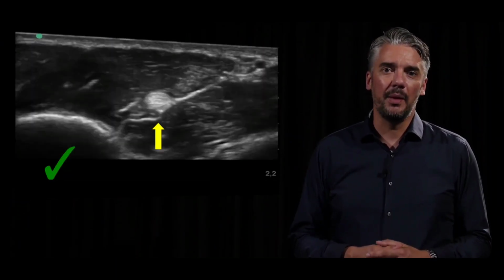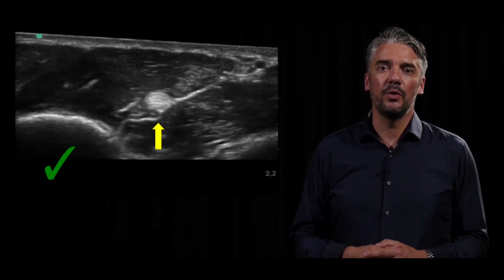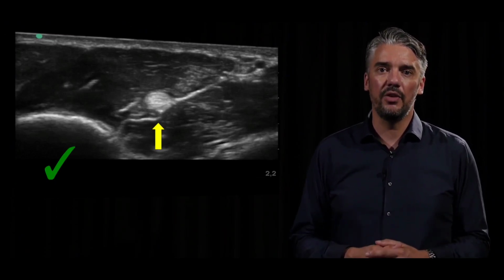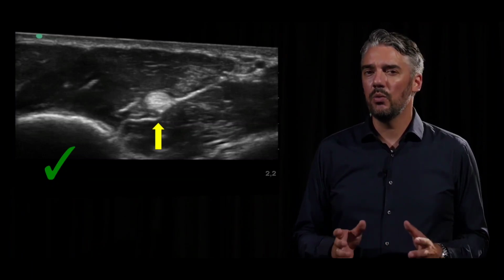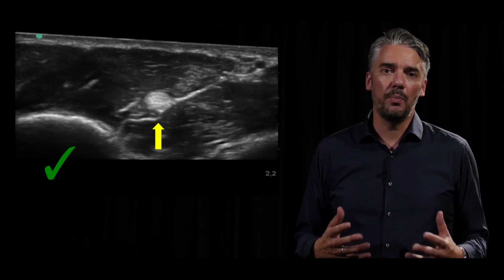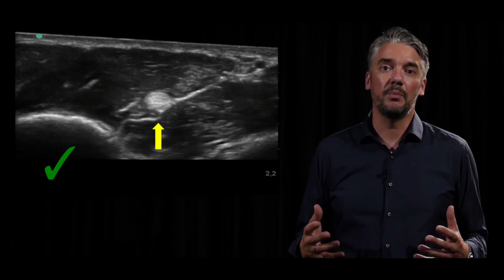This is an appropriate image where all different gray values are balanced out and where all different tissues are clearly visualized. You might wonder then, why is there a gain setting at all? Why don't all people scan with a preset gain percentage?